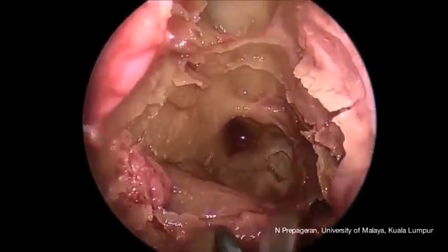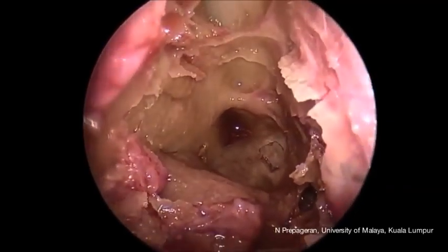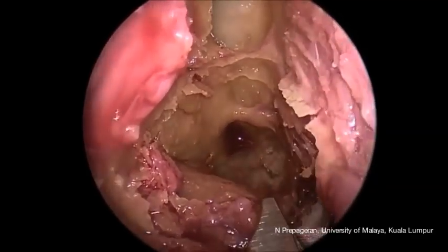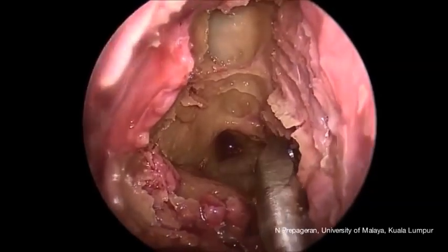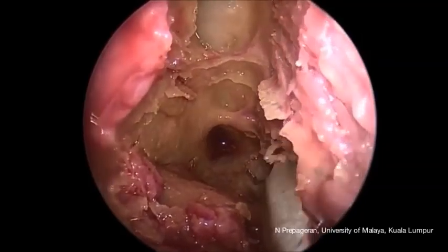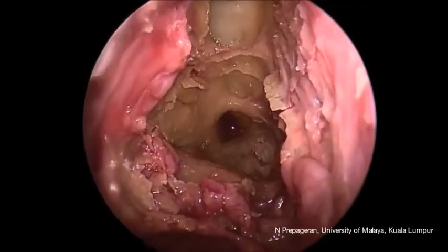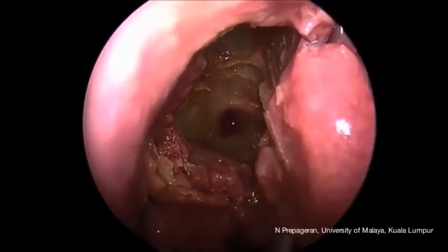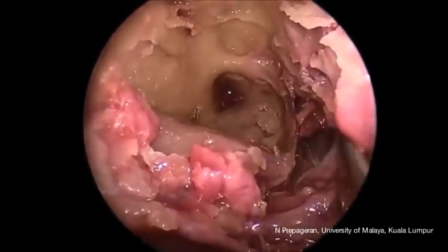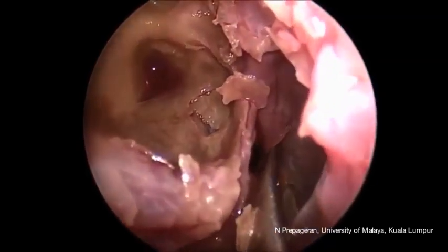So this is the trans-ethmoidal sphenoidotomy. We're just removing a piece of bone from the turbinate itself. So when we enter the sphenoid sinus, we always go medial and inferiorly. Let me just remove some of the pieces of bone from the turbinate itself so that we are able to appreciate anatomy a bit better. And as you can see now, we're going to perform a trans-ethmoidal sphenoidotomy, and that is the sphenoethmoidal recess visualized there with the sphenoid ostia itself.